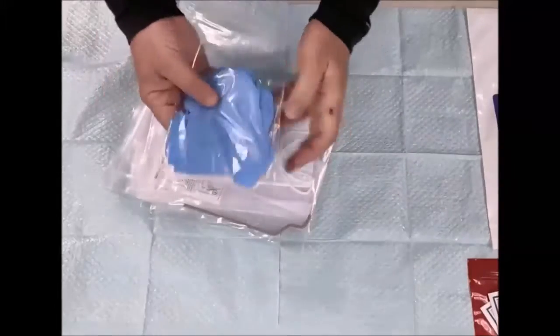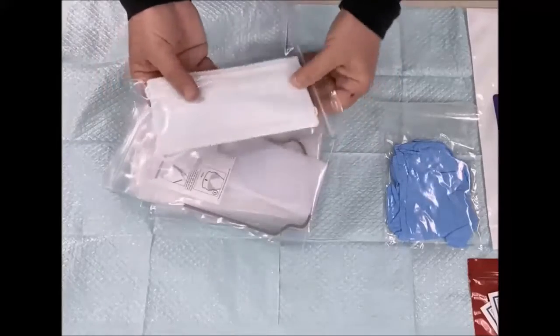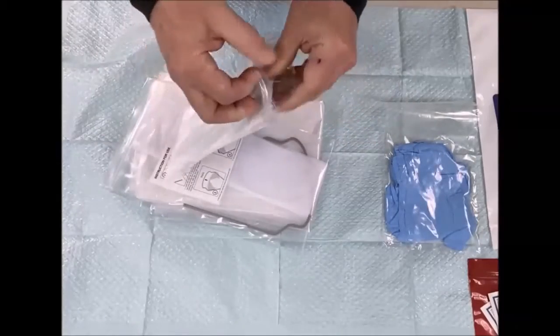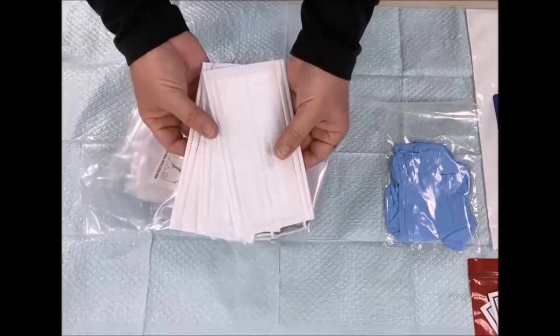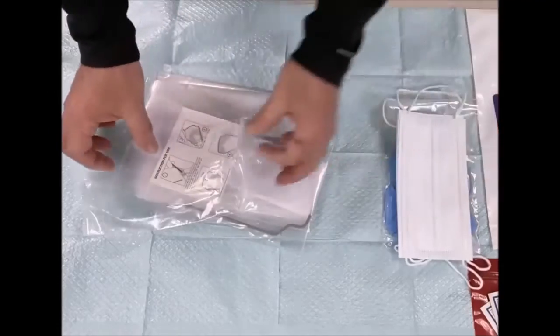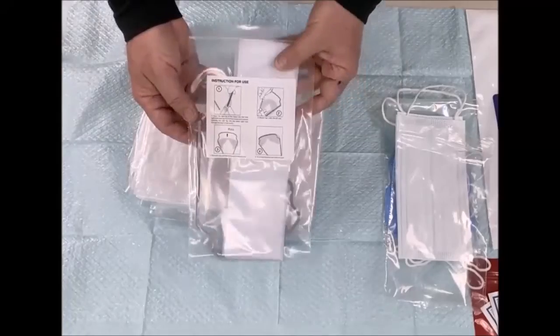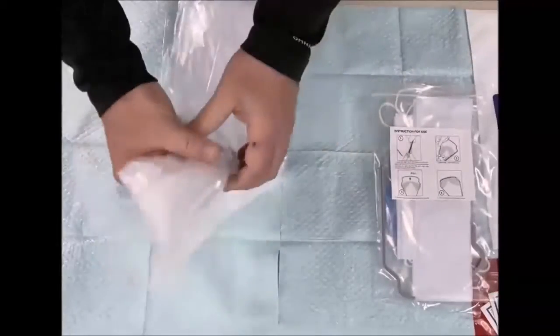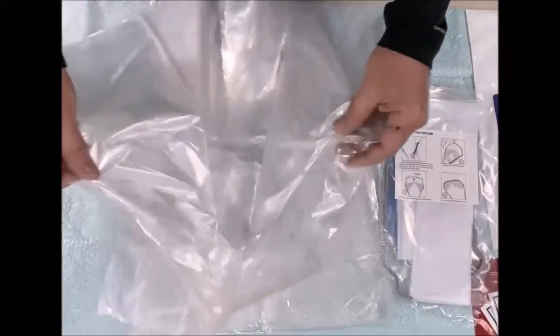Clothes, masks — one for you, another one for your patient, and another one for your assistant. Eyewear, two disposable full chair sleeves. So this is for your chair.